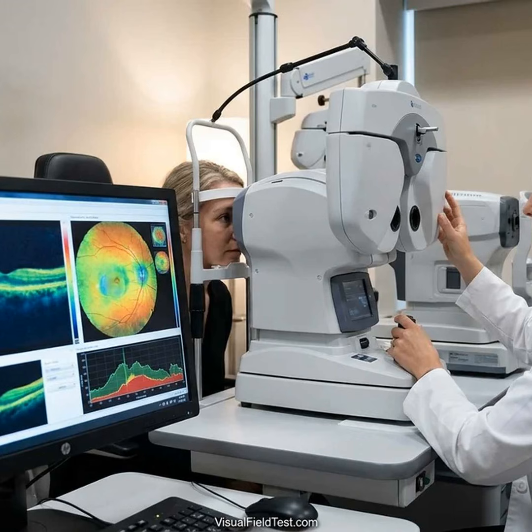remains a reliable friend. Doctors use it to monitor whether the nerve layer is thinning further. Because structural loss often leads to functional loss, OCT changes will usually appear before the patient notices any field defect. In the early stage, the pattern of loss typically starts in the superior (top) and inferior (bottom) quadrants of the RNFL, leaving the central vision until later. Several studies confirm that OCT outperforms visual fields in sensitivity early on.